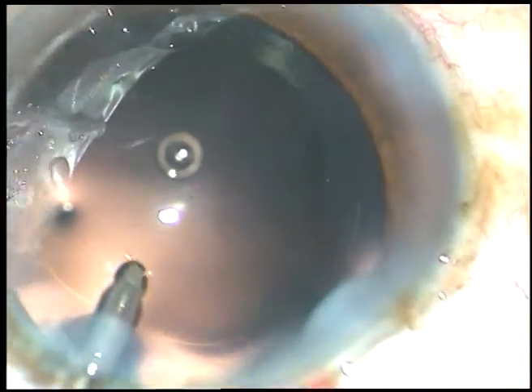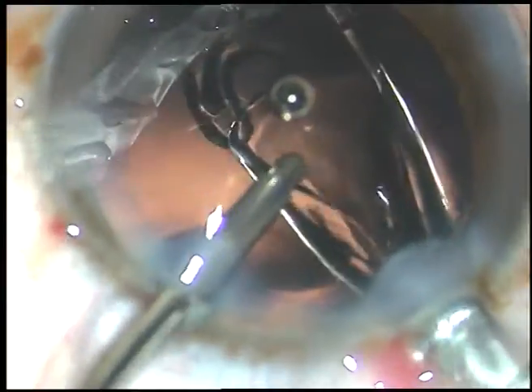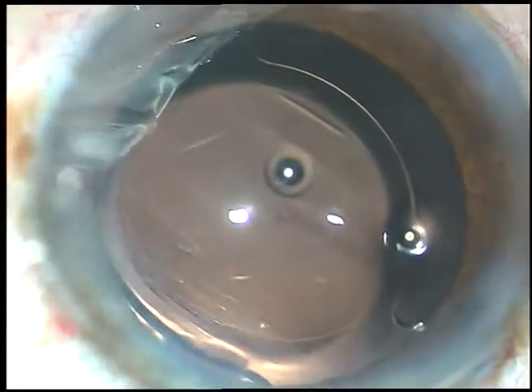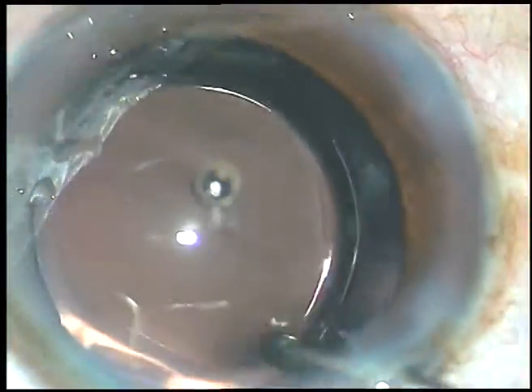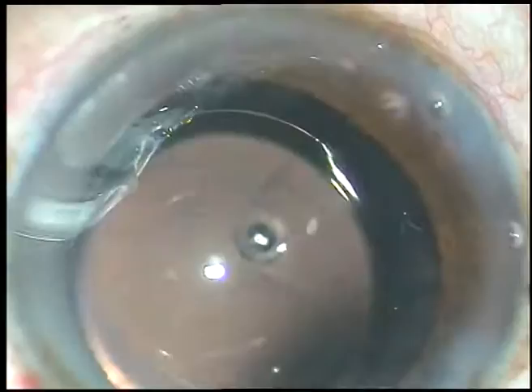Now, after thorough cleaning, a hydrophilic acrylic intraocular lens has been implanted in this case. Now, there is some amount of viscoelastic in the anterior chamber which must be irrigated out. That's it.